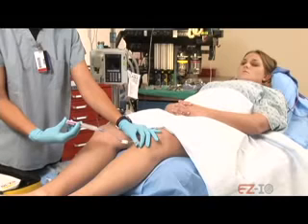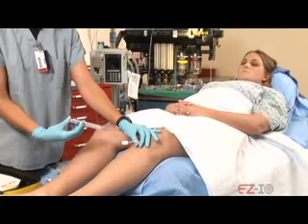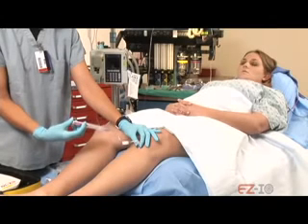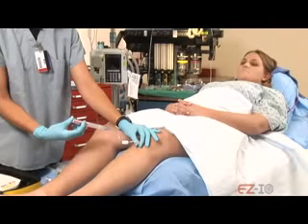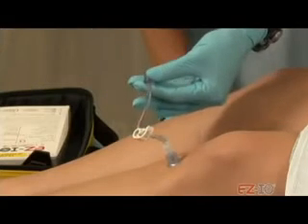And now? Maybe like a 3. Okay. And now? 3. Mm-hmm. Still doing okay? Mm-hmm. What's your pain level now? It's going down. 2.